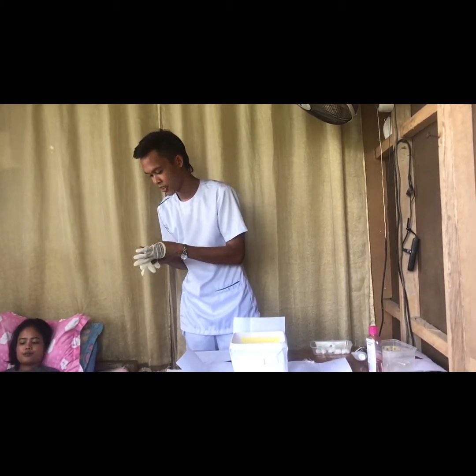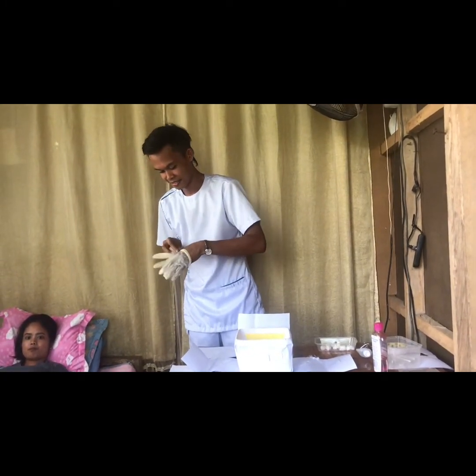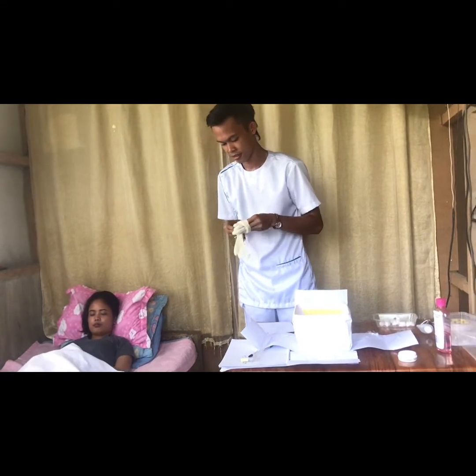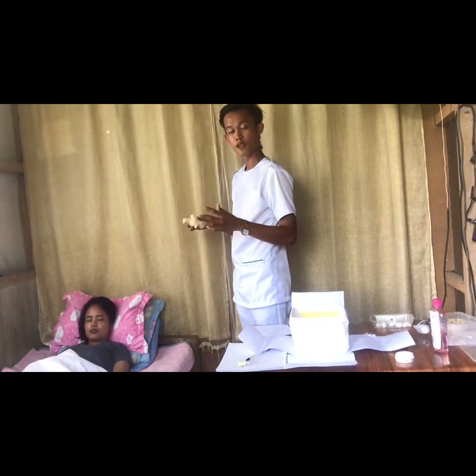Yes. Are you happy? Yeah. Maybe. What's the feeling of catheterization? It's fine. Okay. After that, we're going to dispose of it in the garbage can.